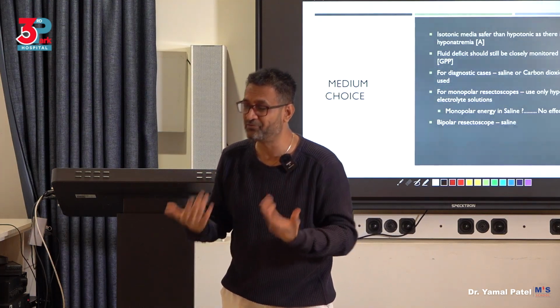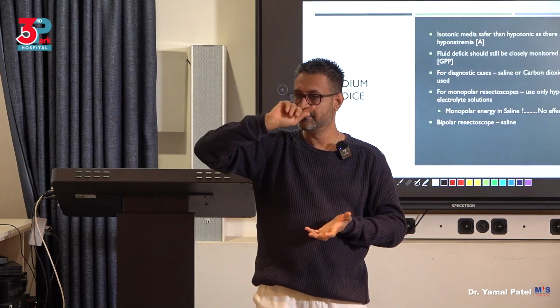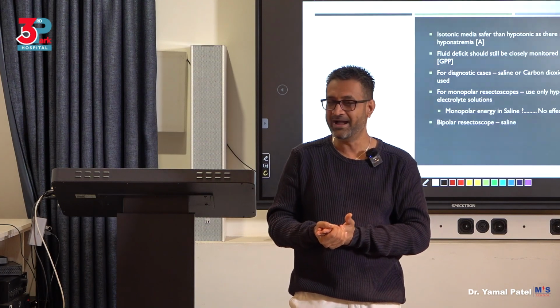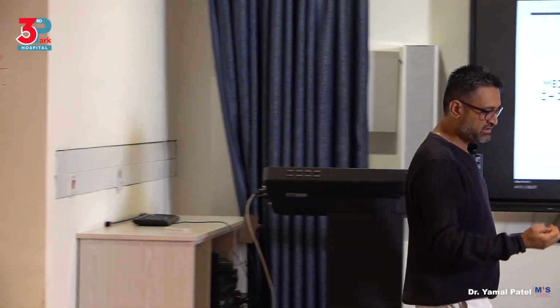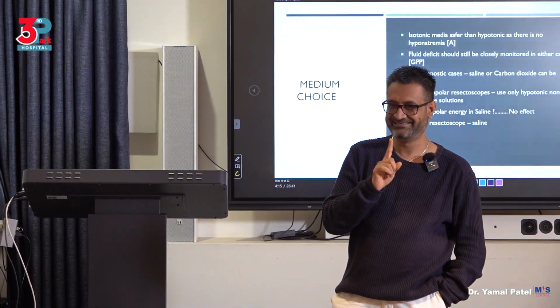The saline is touching everywhere, including the vagina; it's all continuous. So it will never work, because you will never get a focus in one space to burn. It's just spreading out. So saline in monopolar is not used because it will not work, not because it will burn the patient.